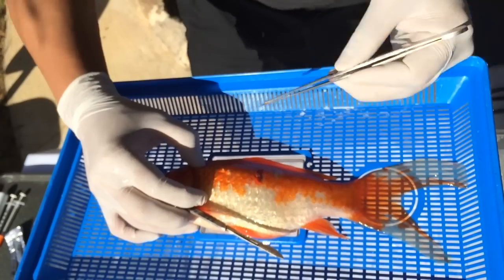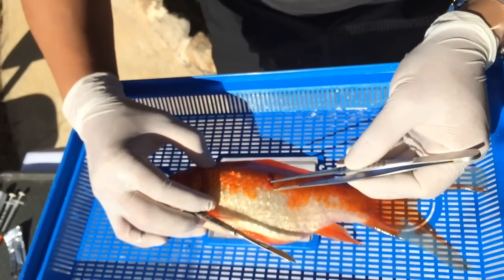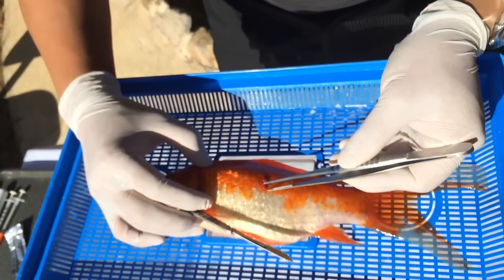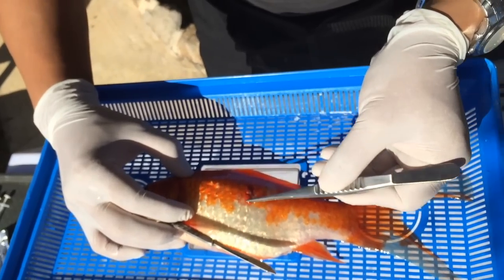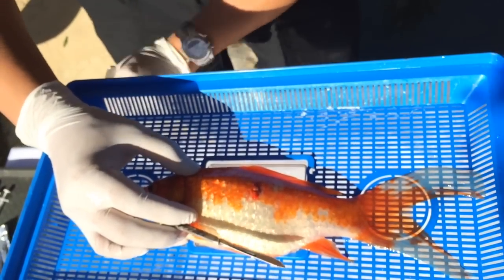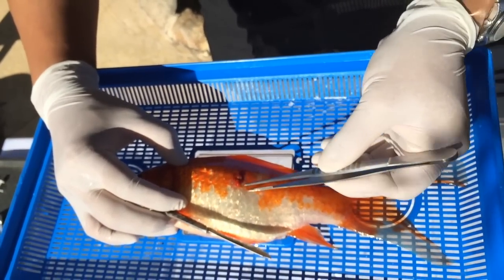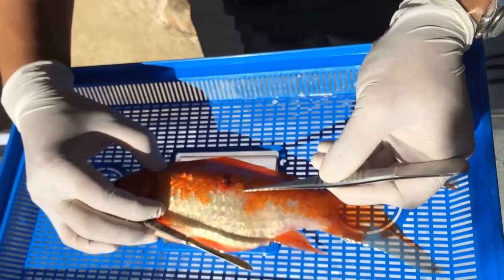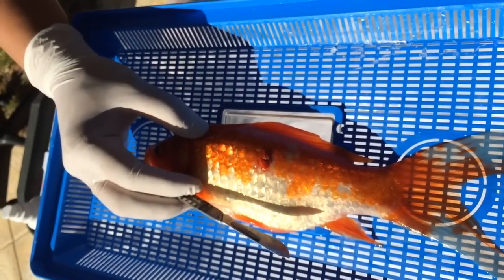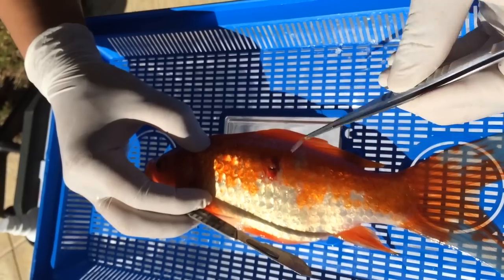The scales will grow back just like fingernails, as long as you don't cause too much damage to the scale pockets. You can just see the way that I'm pulling them out — it's towards the direction of growth. Have a look at how much of these scales are actually under the skin — you can see that a lot of the scales are actually underneath, being covered and overlapped by the one that precedes it.